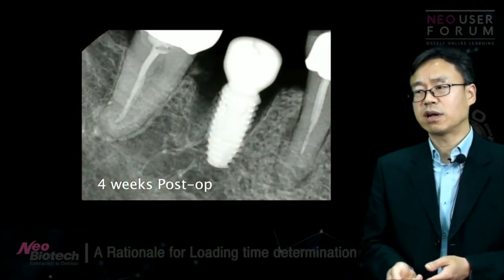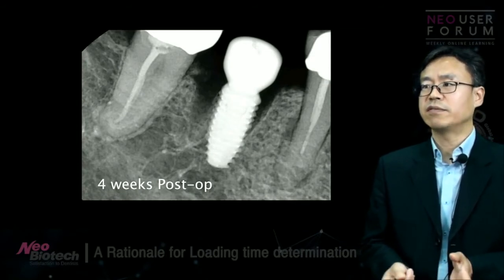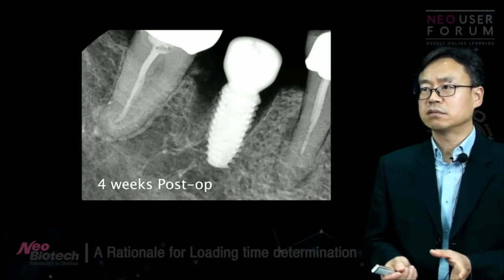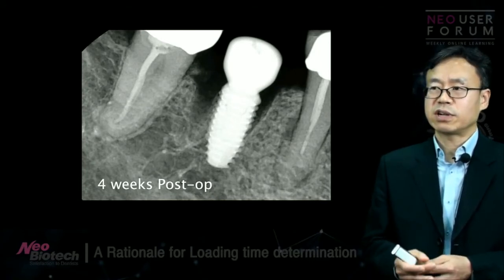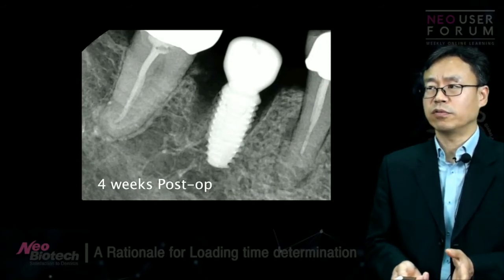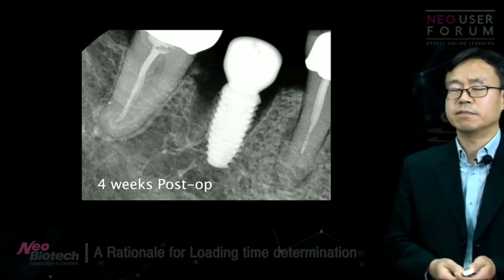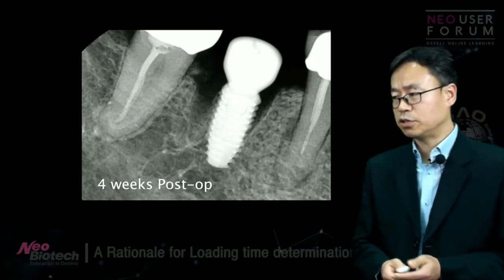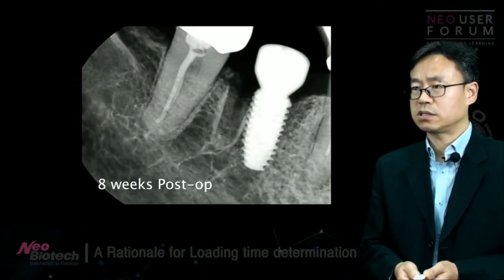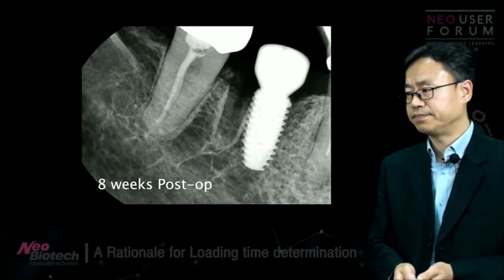Looking at this radiograph, even after 4 weeks, we still have not enough bone healing. Those extraction sockets were not really filled with new bone formation. So we still have more to go in terms of healing. And this has been 8 weeks. And still the bone healing is not completed.